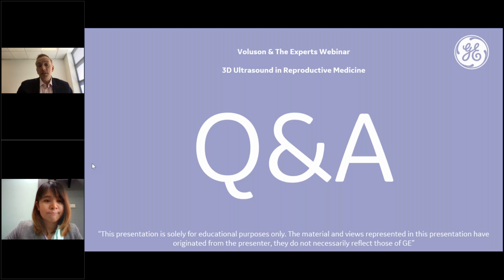Yeah, absolutely. I was going to just move on to show you that. So again, just briefly on that, there are two concepts of endometrial receptivity, the first of which is pathology. So we briefly touched upon that. If you've got a fibroid or a polyp or adenomyosis, do they affect receptivity? I think the answer is they do, but not in everybody. There will be people out there that have got adenomyosis that conceive naturally with no problem at all, and the same applies to fibroids. So unfortunately, it is still a mystery.